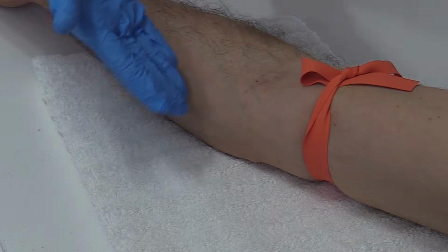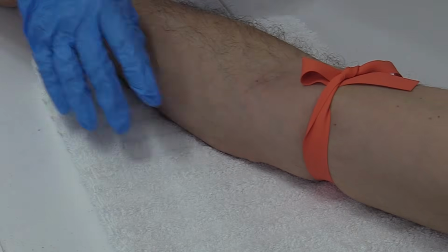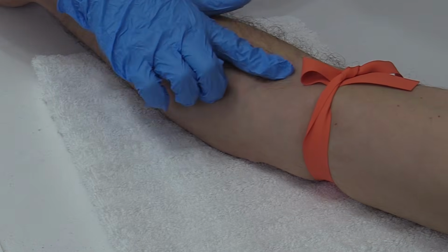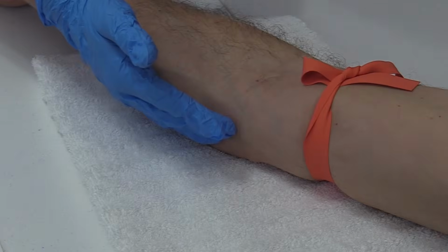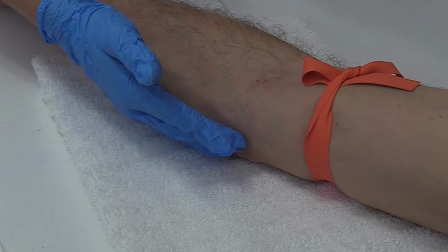So I'm looking for the veins. A lot of times when you pop that tourniquet on, these veins are going to pop out at you, and I'm going to feel around. Veins have a unique feel. They're very bouncy and squishy, and you can feel them. They're not going to have a pulse. They're not going to be cord-like or hard. If they have a pulse, that's an artery.